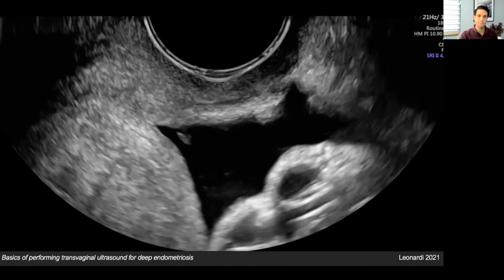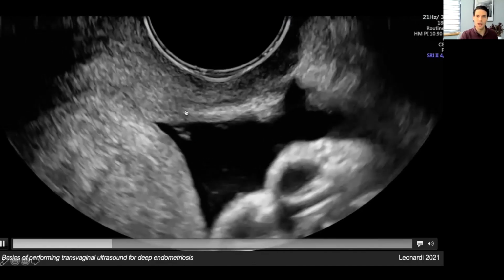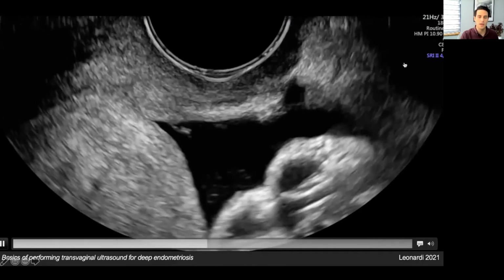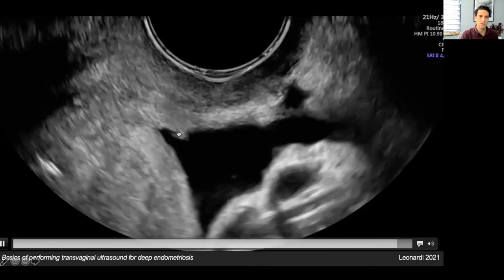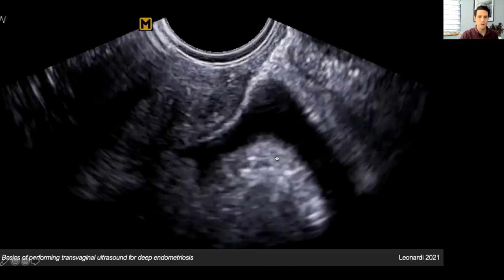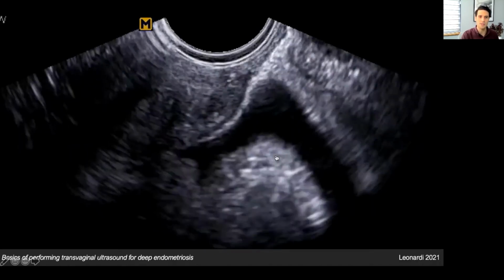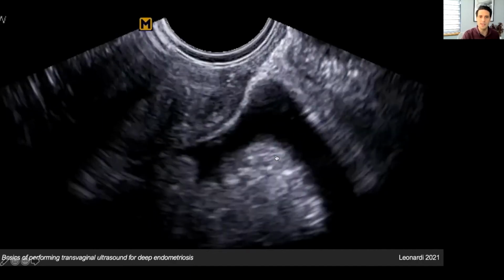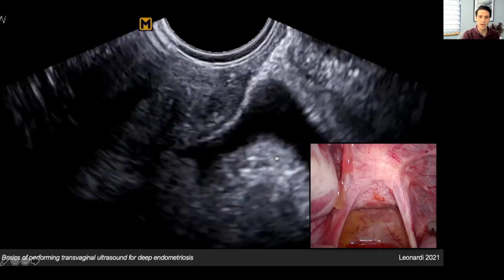Again, in this video here, we have our uterus, we have our vagina, we have the overlying peritoneum, we have bowel here. These nodules, or deposits rather, nodules may not be the appropriate terminology here, are superficial endometriosis. In this video here, we have a very clearly depicted projection off of the peritoneum that's just overlying the back of the vagina, essentially very close in proximity to the cervix. And again, I haven't shown very many surgical depictions in this, but this is the exact surgical depiction of this lesion.